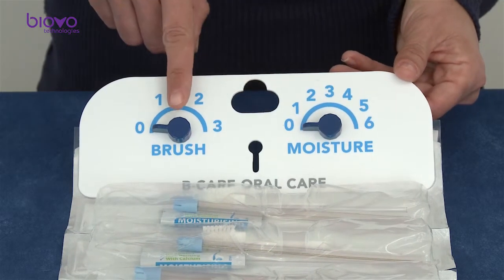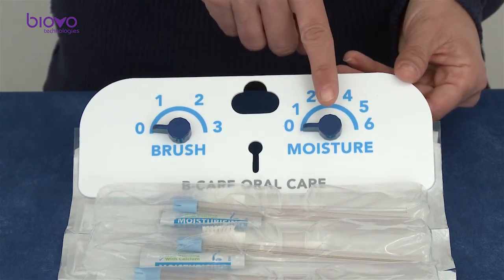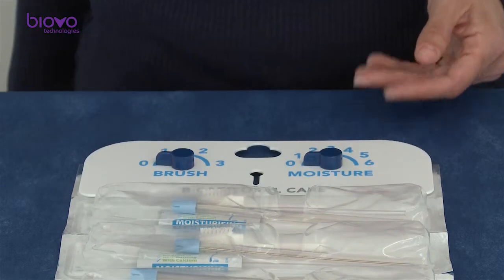On the board, there are two counting dials which allow you to keep track of the operations done during the 24-hour cycle.